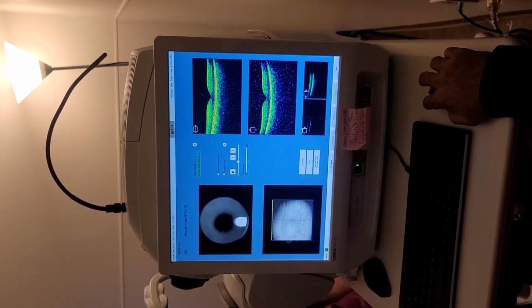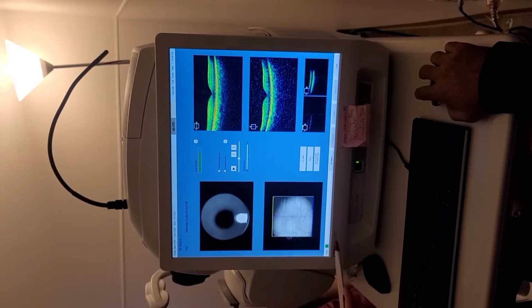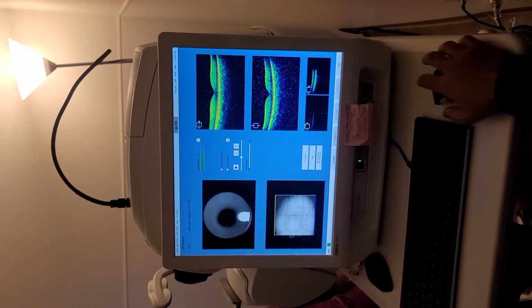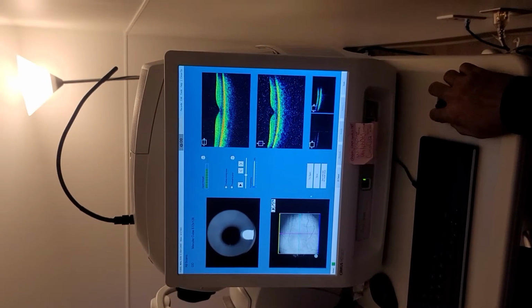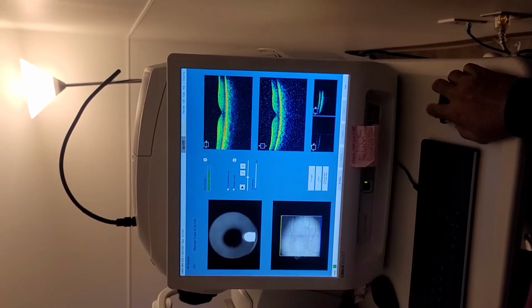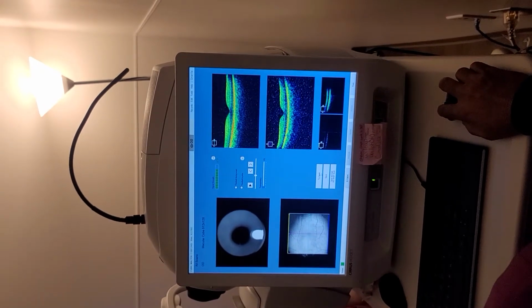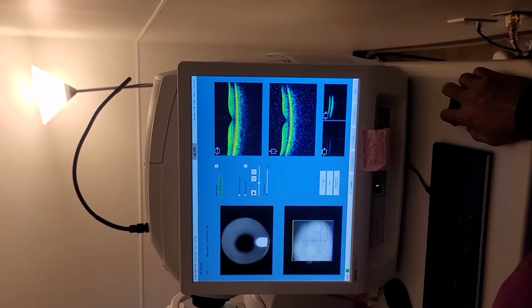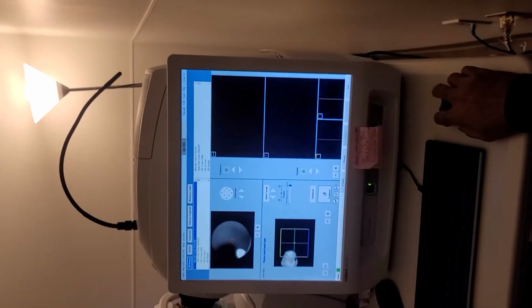Save. Yeah. Now, do you want to do anything here? Do you think it's good, or do you want to redo it? Judge, redo it. You want to redo? Okay, then retake. Yeah, try again. Please, once again, you put your chin towards the blue line. And then just say, yep, try again.